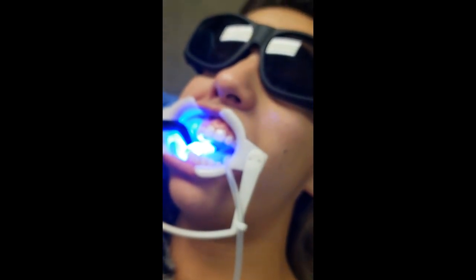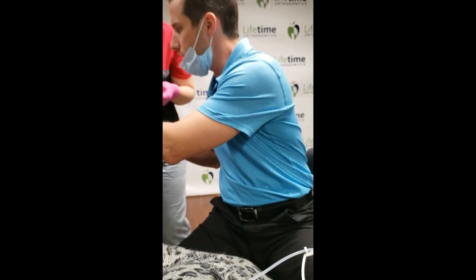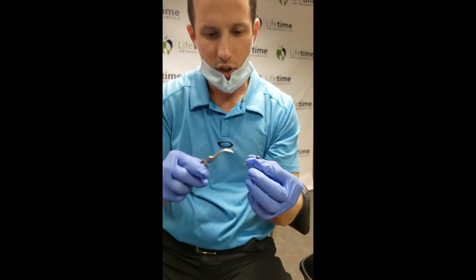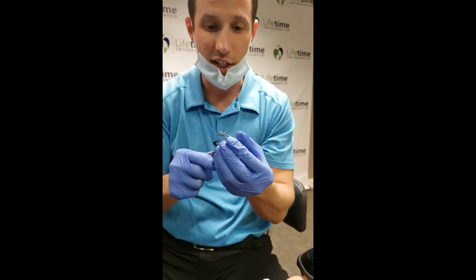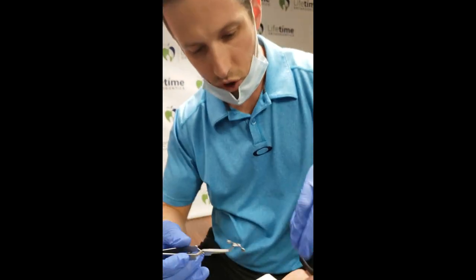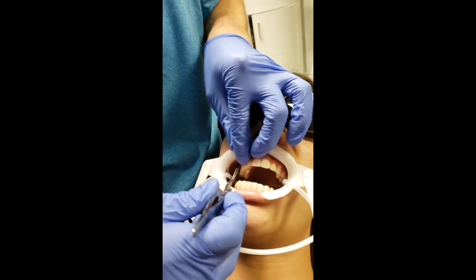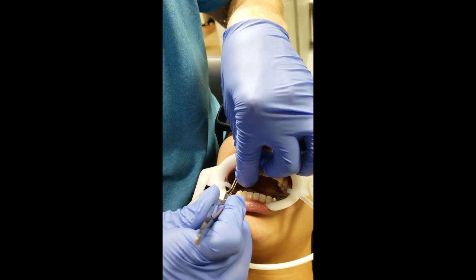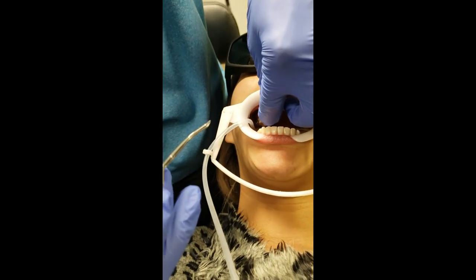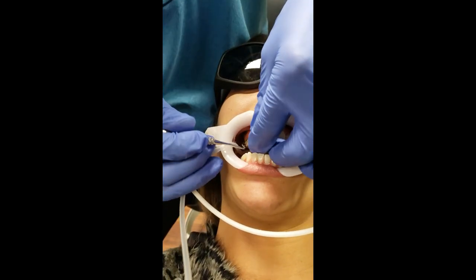A lot of times I'll place them and light cure them together, but we'll do a little tack here. I like to use these to hold the appliance. I can use a wing guard as well if you're placing these. I place it on that six, kind of hold it at the canine and then release, then come back and contour it a little bit better. These are ones where I don't mind having a little bit of extra adhesive.